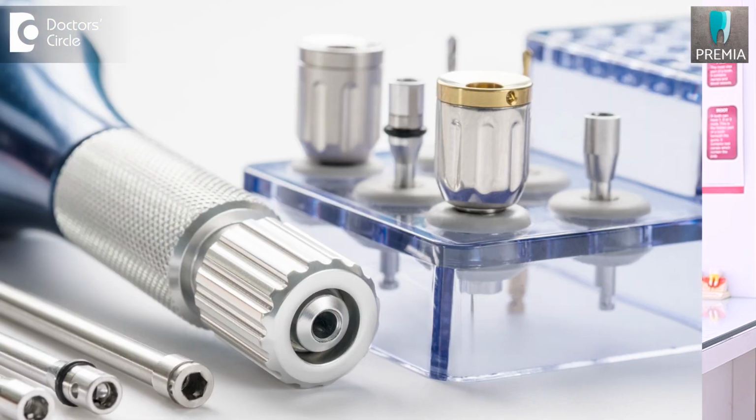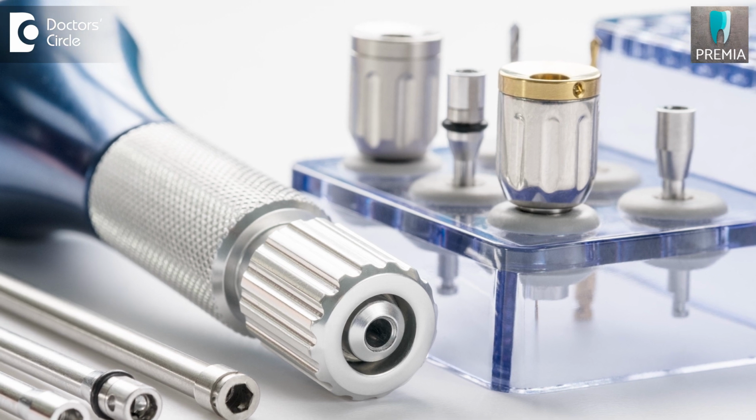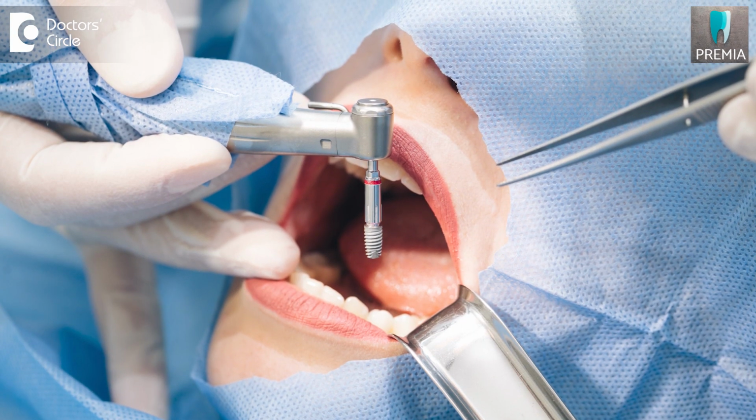I would want my patient to come and reduce the values of sugar and then go forward with placing of the implant. So an implant is nothing but a minor surgical procedure wherein you have various drill sizes. You drill the bone; either you can expose the bone or you can directly do it with the soft tissue. I prefer exposing the bone and then placing the various drills according to the size and length that you have determined, and then place the implant. Once you place the implant in position, you place what is known as the cover screw and then you suture it up and allow the implant to heal.